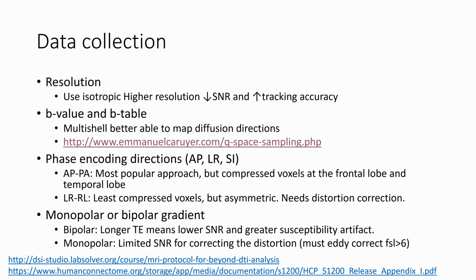The actual size of the white matter nerve bundles is way too small to actually work with, and as Tom was discussing, you're really looking at the aggregate shift possible. You're not looking at the specific fiber bundle itself, just the aggregate movement, the diffusion of water. He also discussed how, as you modify that B value, you can get a more precise measure of the amount of diffusion. As the B gets larger, the delay gets larger, you can actually see things move across the gradient more effectively than when you have a B of 0 and you're just getting the image at the time, essentially.